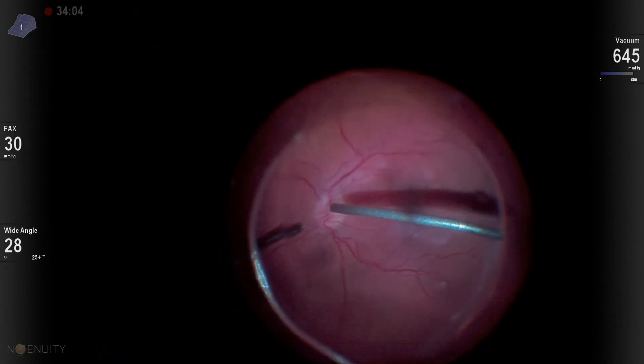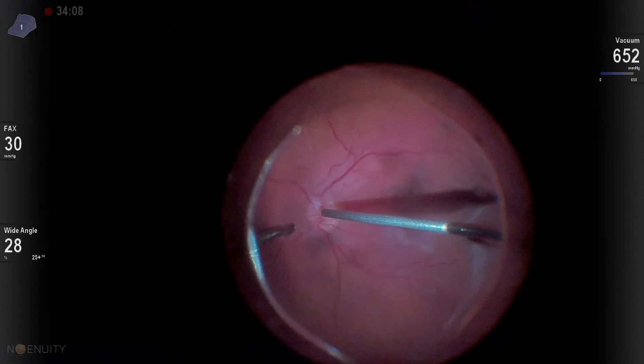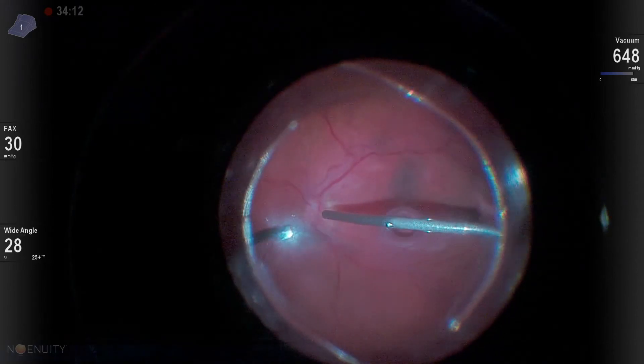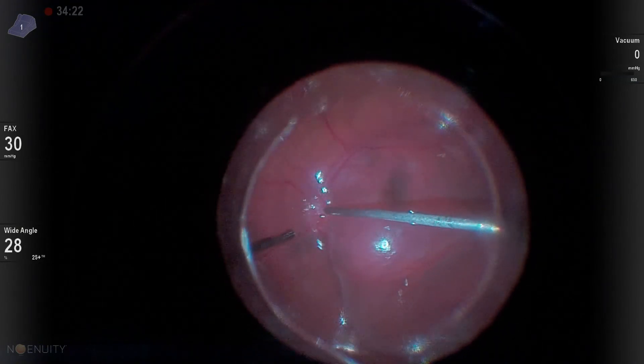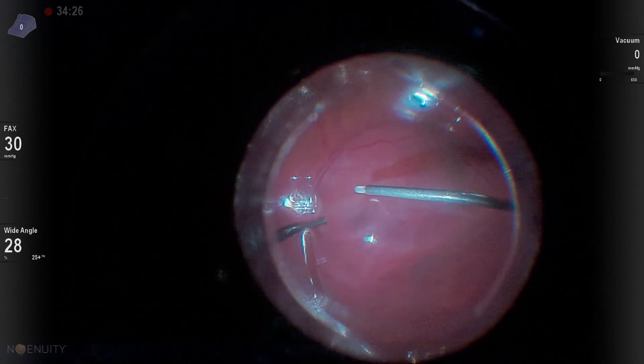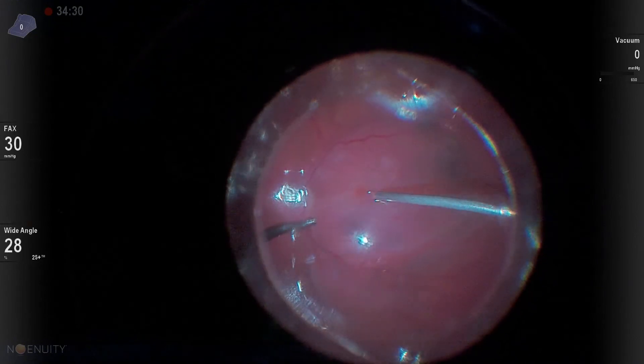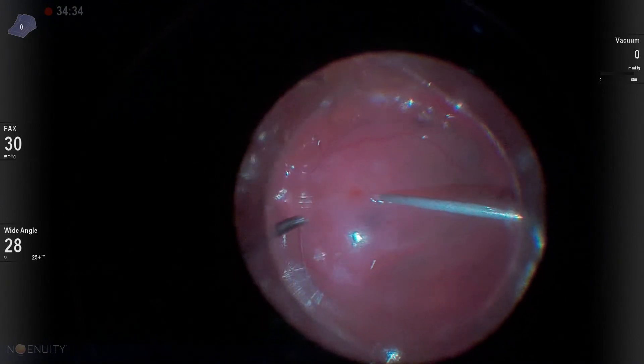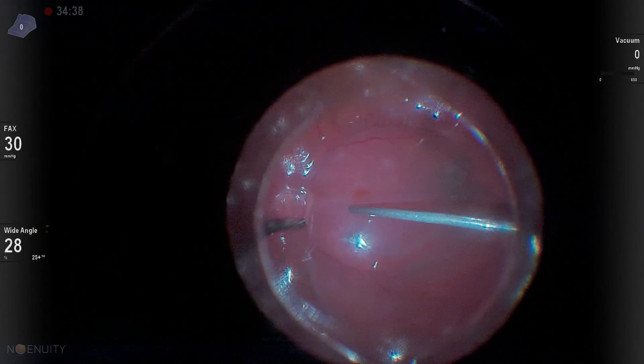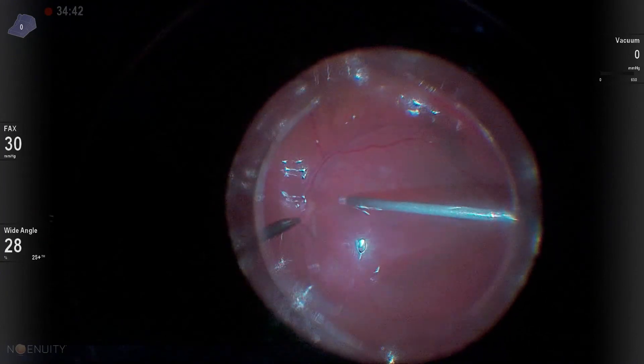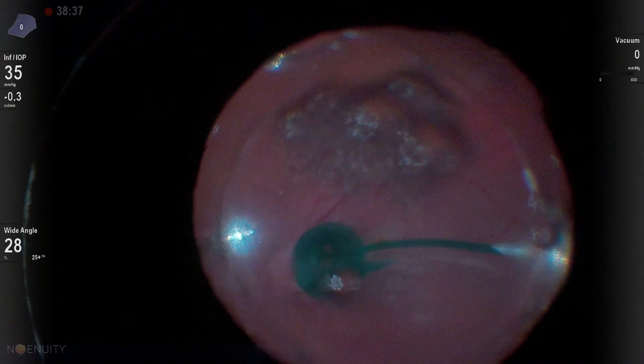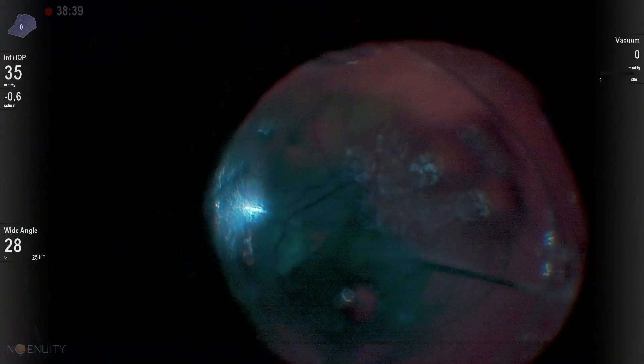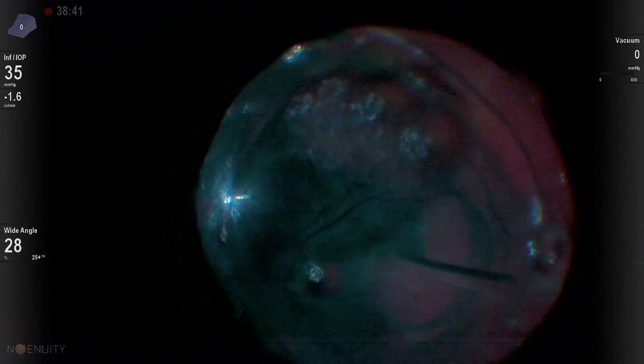And so this time I decide after a third stretching technique here that we'll go through really quickly, that I'm going to start to attempt to peel this patient's internal limiting membrane fully underneath the perfluoron, which should hopefully make it much, much easier. Now I'm kind of stroking the surface of the retina here because there is a little bit of residual fold, and this is under fluid or under air with the fluid in the macula. Now I stain again with ICG.